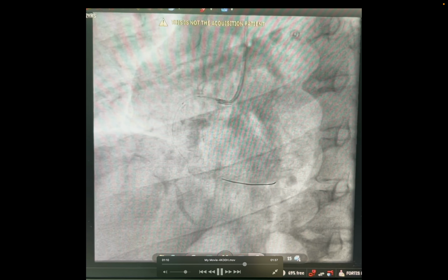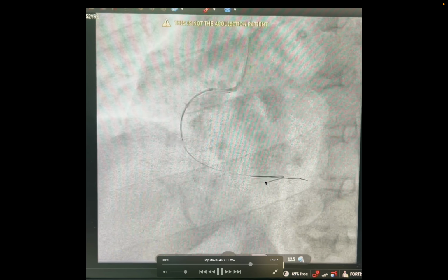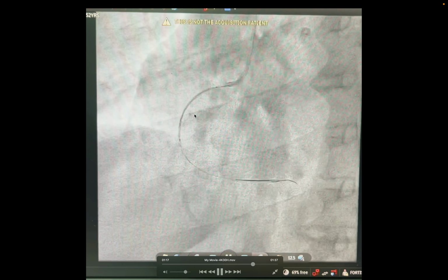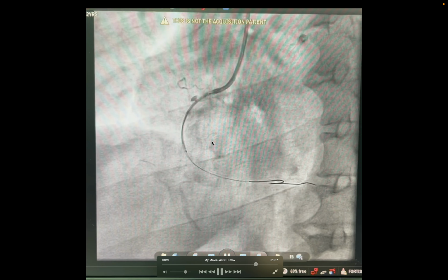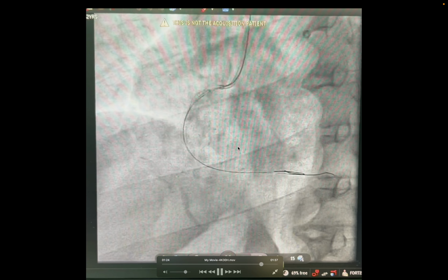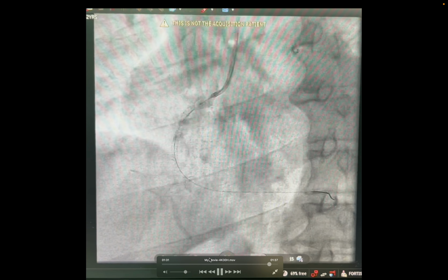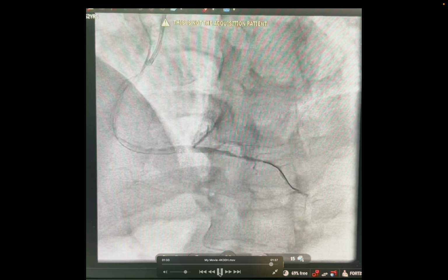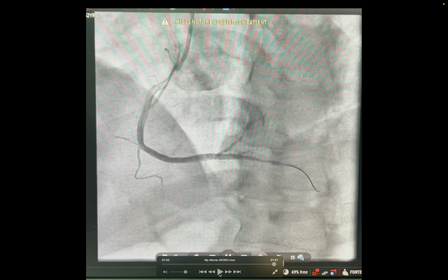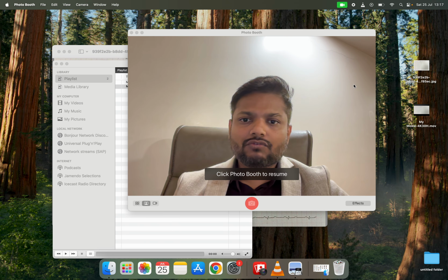So it was a very tedious job, and fortunately I can see some flow in the artery. I have to take multiple balloons for putting a stent, and I'm taking a stent to open that artery. As you can see, this is a time sensitive matter. So here you have to put in the stent and come out immediately. After nicely putting the stent, I'm able to achieve a very nice flow, as you can see. So the artery is opened, one stent has been put, and the patient fortunately has survived, and was taken off the ventilator.